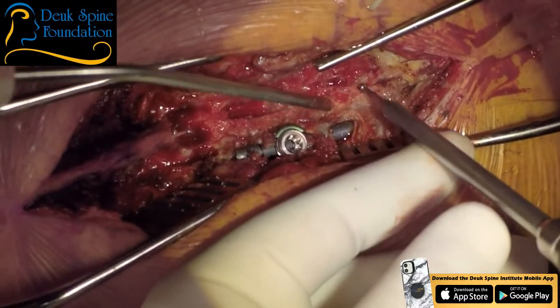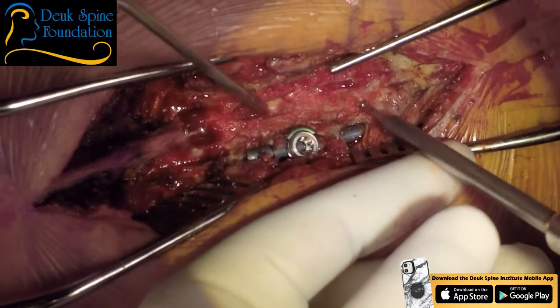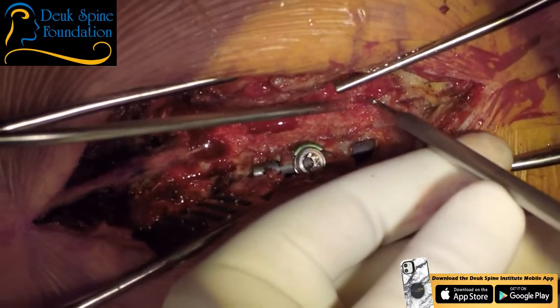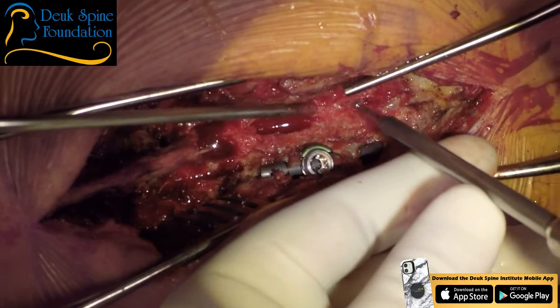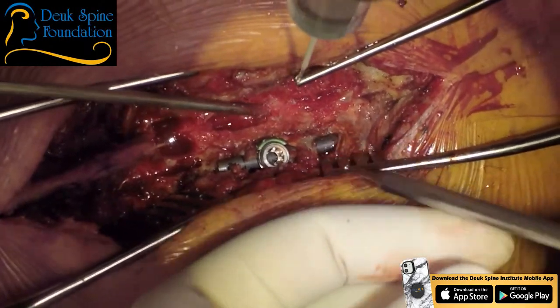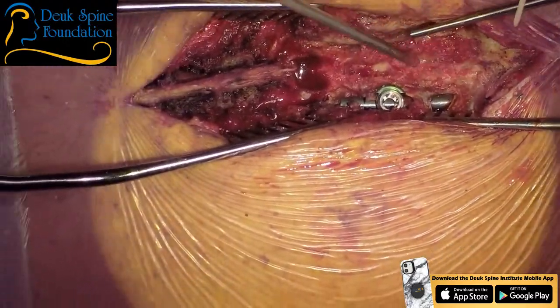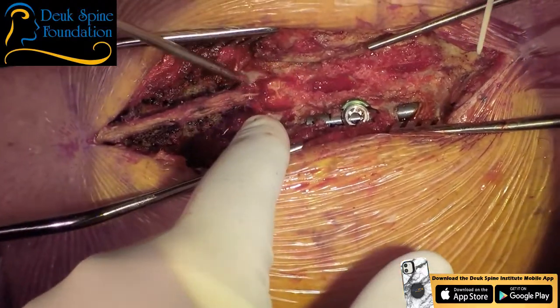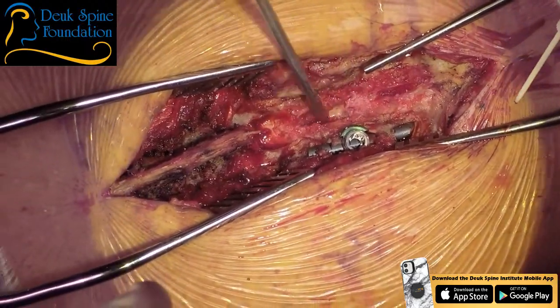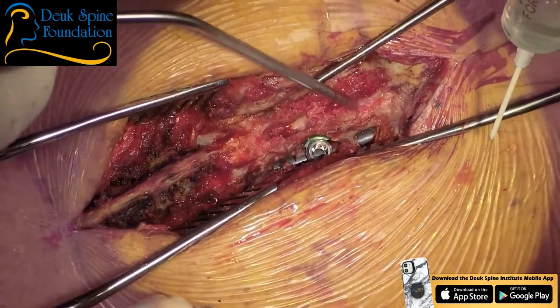All right, now. So, what is that? A little bit of scar tissue? Yeah, maybe the spinal cord. Let me see. I'm coming towards you. All right, probably the best thing to do at this point is let's go up here where we know there's normal anatomy. We're not gonna crack anything. Put some gel foam there.